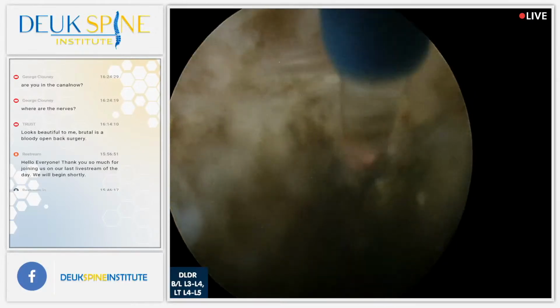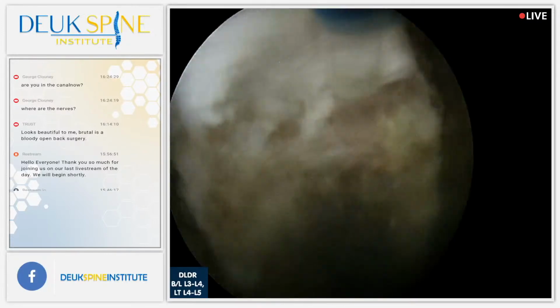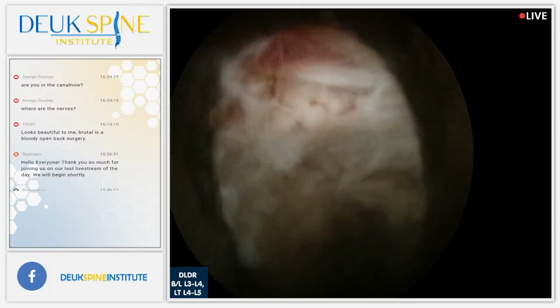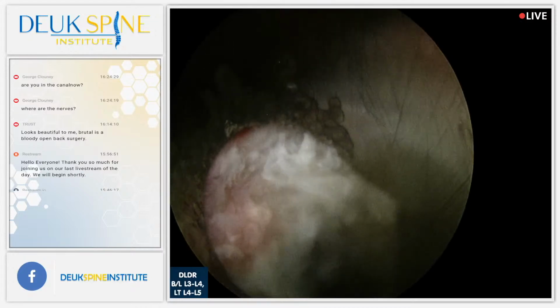But Yoda is Dr. Anthony Young. Dr. Young is, of all the endoscopic surgeons for the lower back, that is, not for the neck, the one with the most experience in the world that I know of. He's done more cases than me. There's your nerve, by the way, right out there in the foramen. You can't even see it.